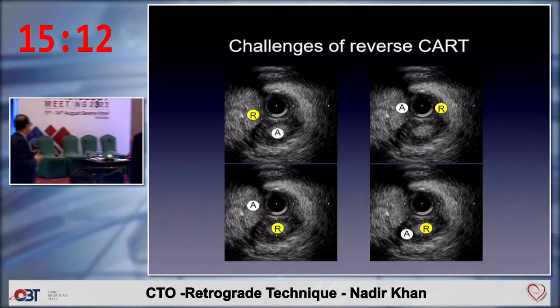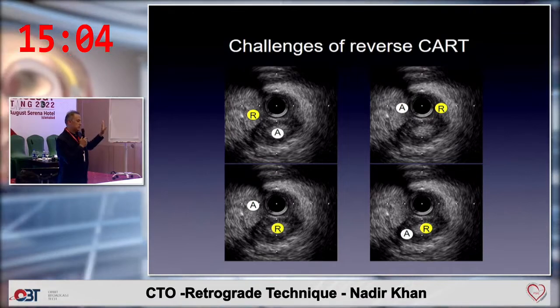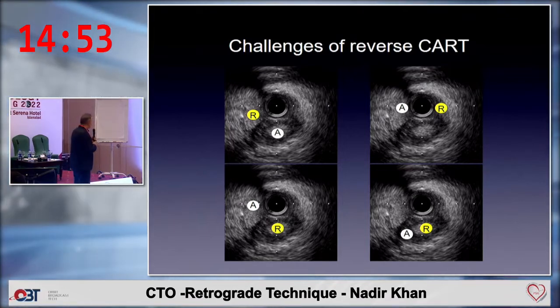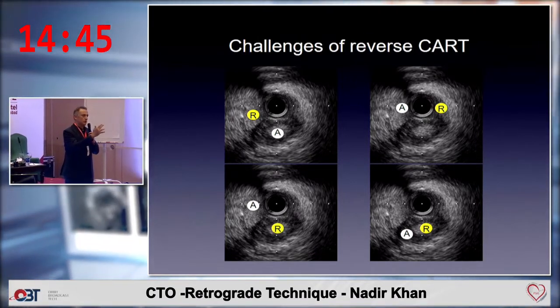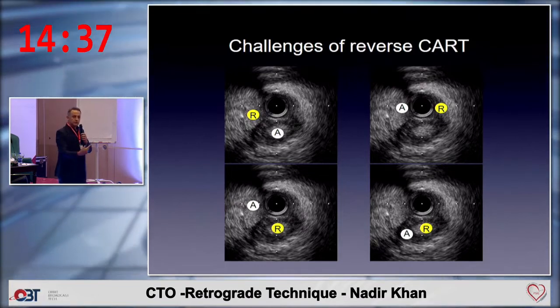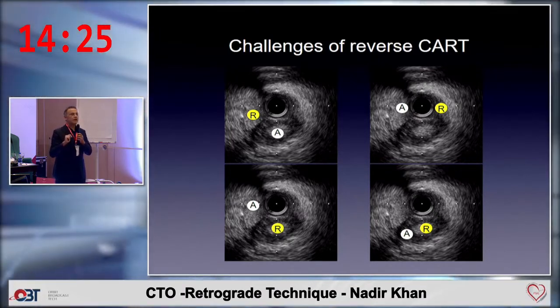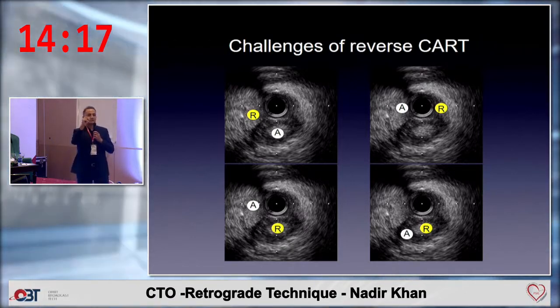Yes. Mainly why we do reverse CART: when we go from the retrograde side, our wire has to be in the true lumen at the proximal part, proximal to the CTO, right? Sometimes it's difficult. The best scenario for retrograde is that your wire can easily cross the CTO intraluminally. It sometimes happens that your wire crosses through the CTO into the proximal lumen. You push your microcatheter, change your wire, and have a loop. But it's not that often. Mostly from retrograde we go either intimal or subintimal, and at that time it's not easy to find the proximal true lumen.